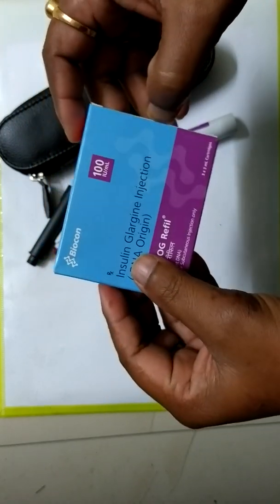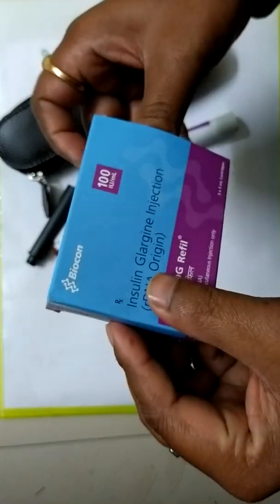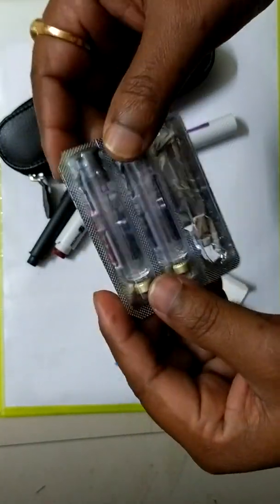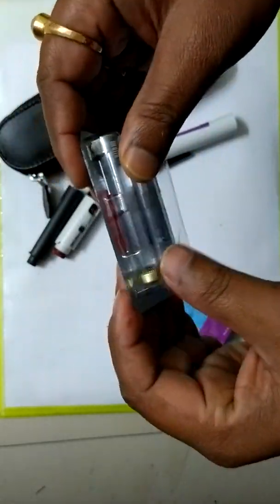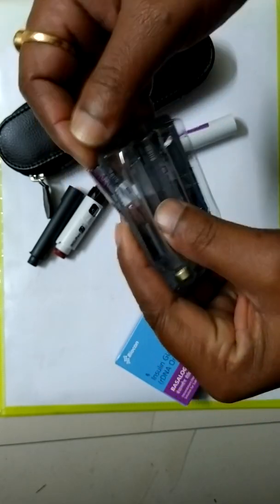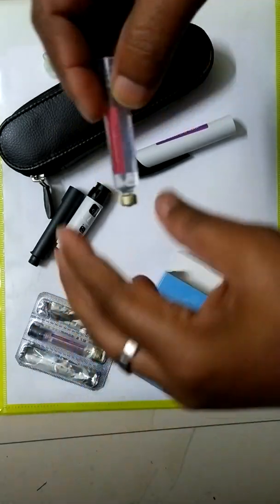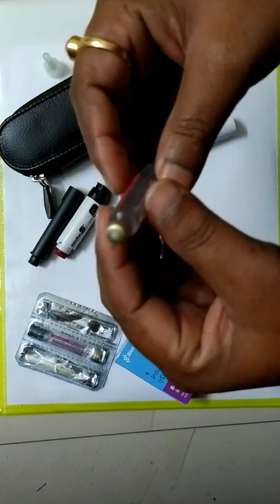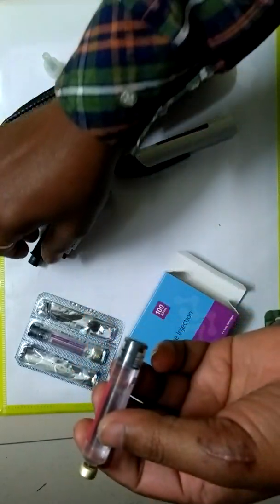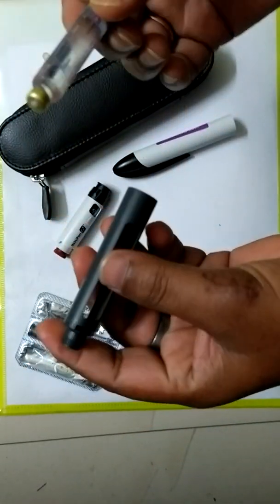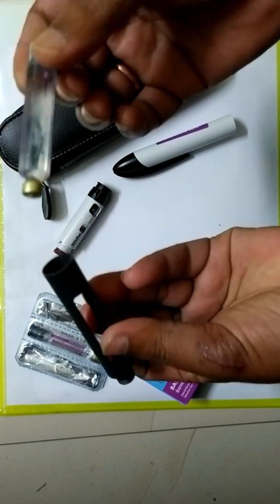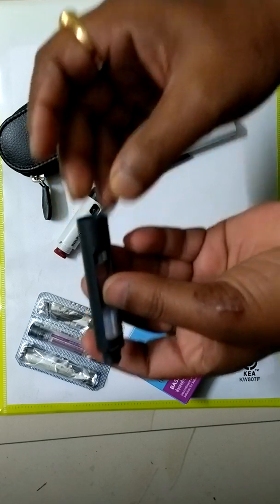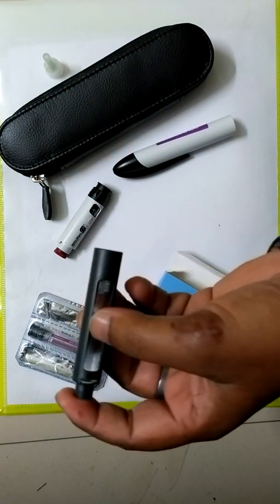Now we are going to fill the pen with a new cartridge. These are the cartridges. This is the plunger stopper of the cartridge and this is metal head. Metal head should be in this side. I am inserting the metal head in the cartridge chamber.